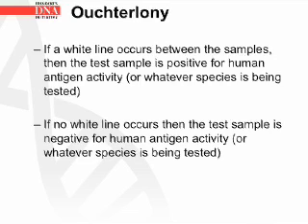If a white line occurs between the samples, then the test sample is positive for human antigen activity, or whatever species is being tested. If no white line occurs, then the test sample is negative for human antigen activity, or whatever species is being tested.